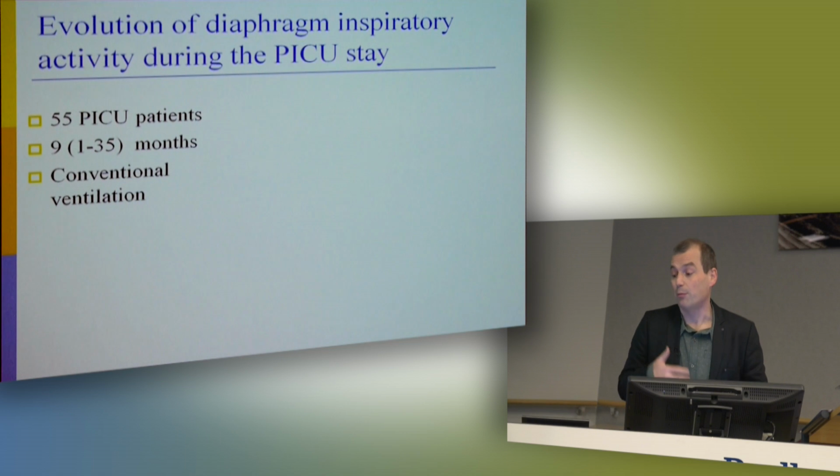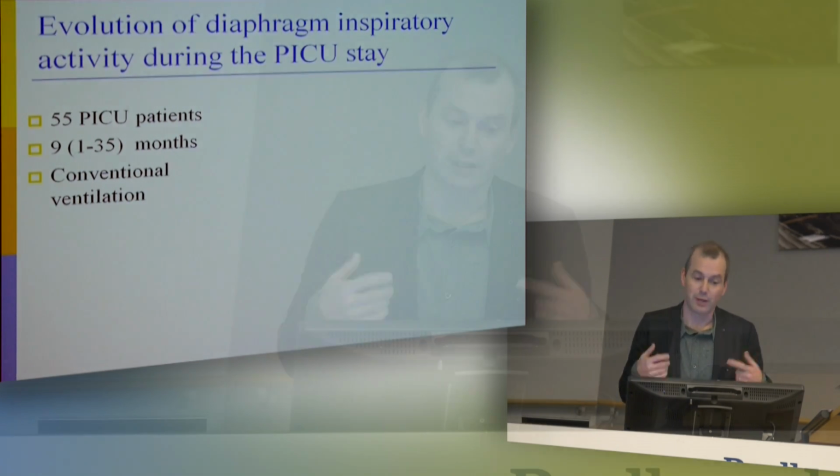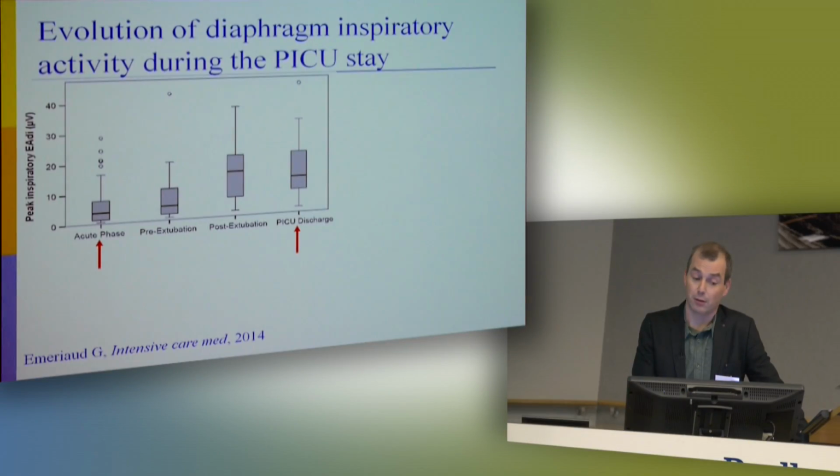It was when the physician thought that the patient was contributing to his ventilation. And I have to mention that neuromuscular patients were not included in this study. It's important.